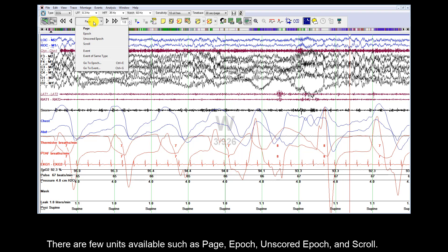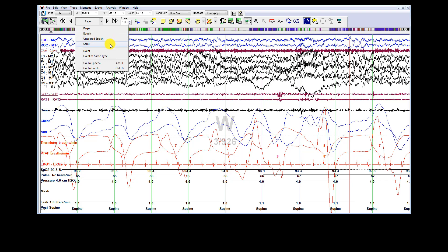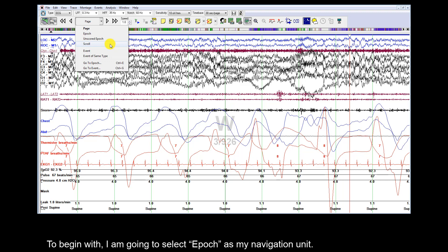There are a few units available such as Page, Epoch, Unscored Epoch, and Scroll. To begin with, I'm going to select Epoch as my navigation unit.